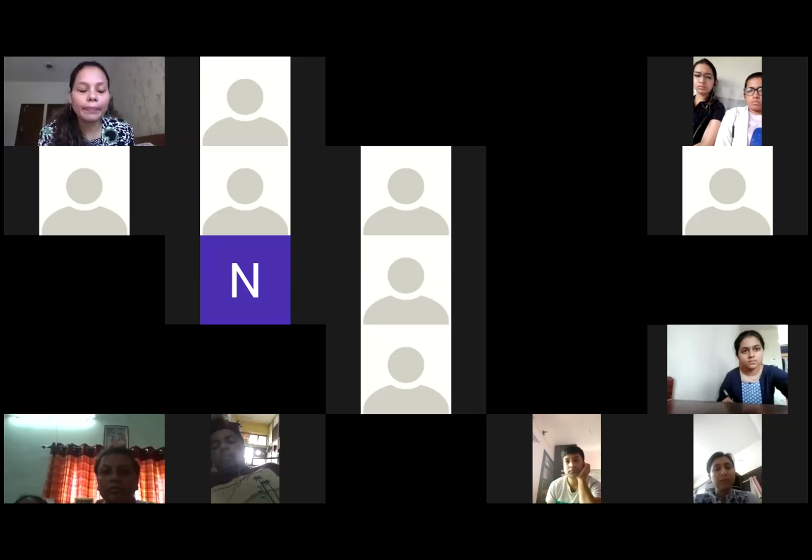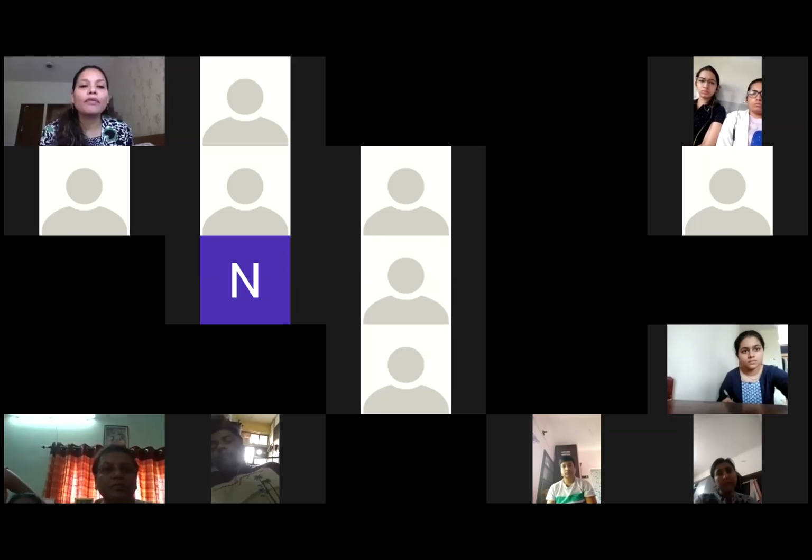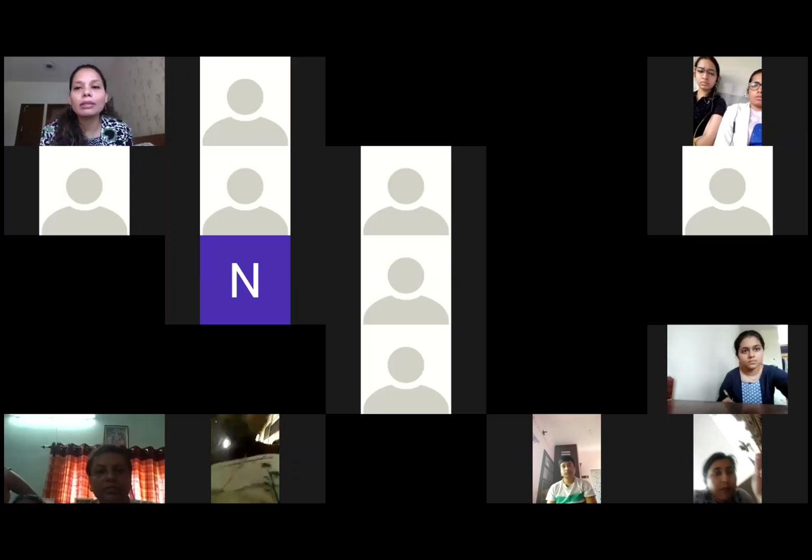I just wanted to ask you, in which patients would you suggest full field 120? Yeah, so as I mentioned, I would do it if I'm suspecting a pre-chiasmal tumor or a spread there. Patient is complaining of decreased vision, and I'm getting one field involved. The other eye, if I want to pick up a junctional scotoma, then I would do. But routinely, we don't do that. If I want to look at some peripheral constriction areas for early cases of papilledema, to look at early constrictions, I would do it.